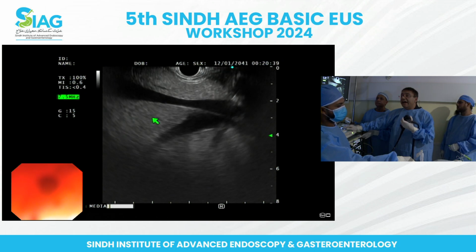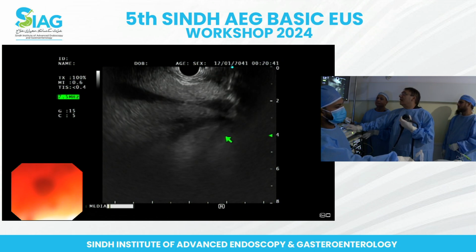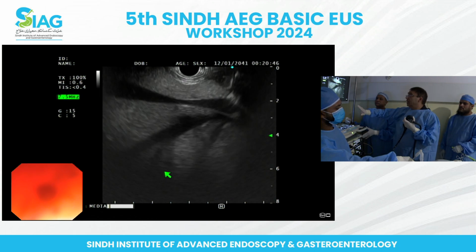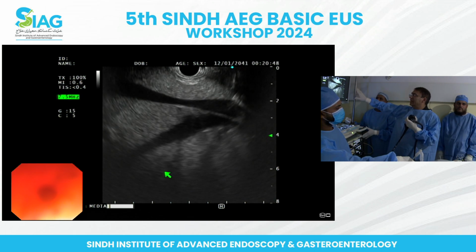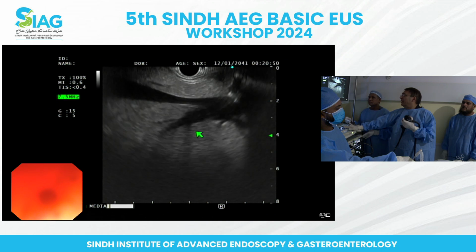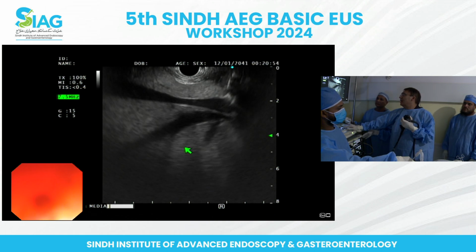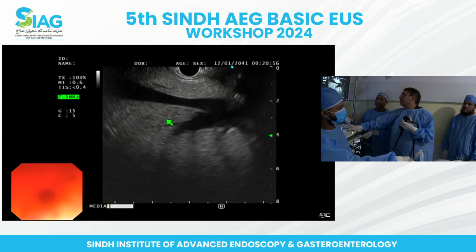Segment above that, segment 8, segment below that, segment 7. So these are the segments you are able to see from the liver. This is very nice, a big trunk that tapers down there, and segment 7 here, segment 8 there.